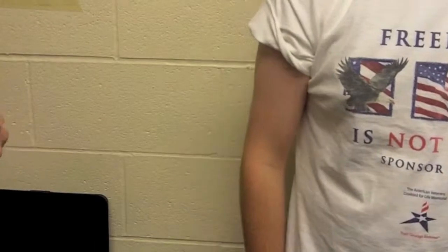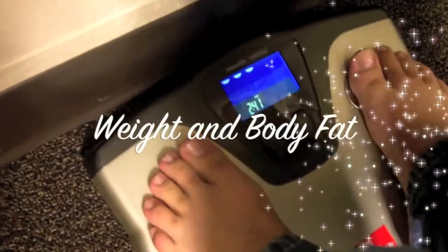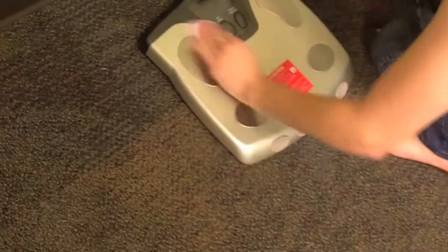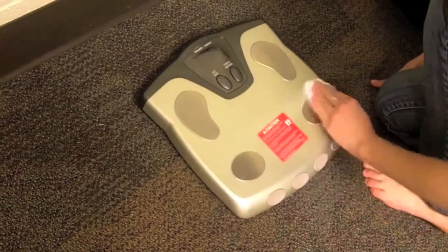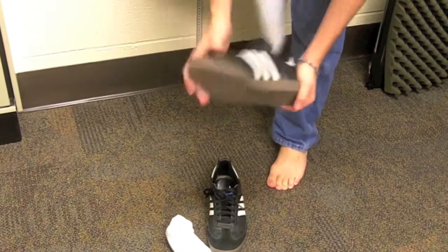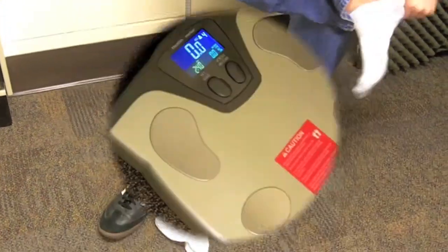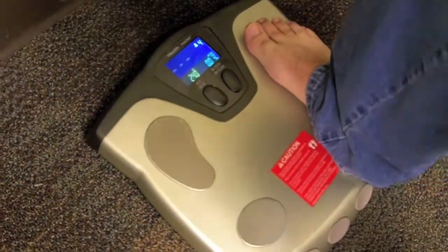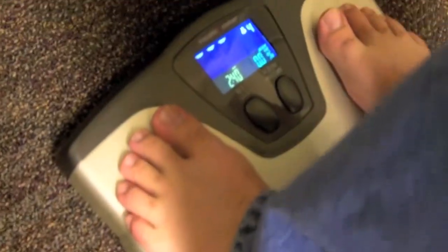How to measure weight and body fat percentage: Prior to taking the participant's weight, be sure to clean the scale's surface with a disposable disinfecting wipe. Instruct the participant to remove shoes and socks. Record the weight in kilograms and body fat percentage. Instruct the participant to put their socks and shoes back on.